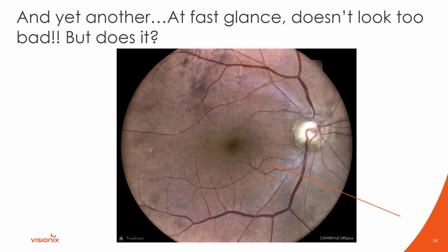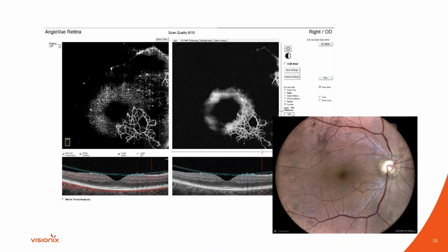big problem. And you would never guess, this is crazy, but if you move your segmentation lines up to the vitreoretinal interface, look at this neovascularization. I was so impressed by this. It was just such a phenomenal image. I didn't think patients would get a neovascular response with very limited retinopathy, but this is a very ischemic eye. And maybe this would have been missed without looking at the angiography and understanding how to move the lines and really hone in on this anomalous area.